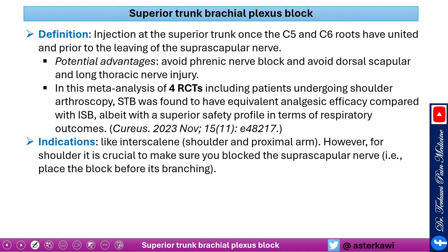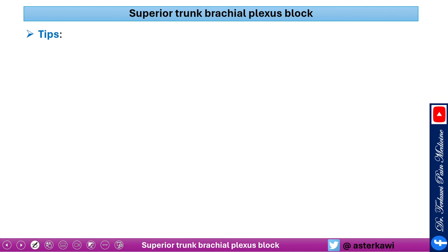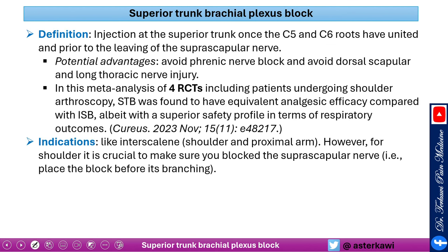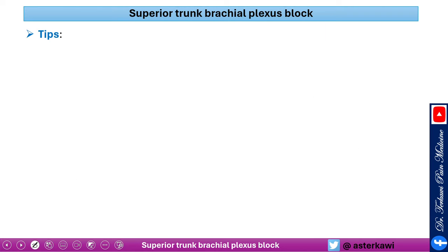The indication is similar to interscalene — shoulder and proximal arm. However, for shoulder surgery it's crucial to ensure you also block the suprascapular nerve. Sometimes supplementation with supraclavicular nerve block is also needed. Position the patient like the interscalene setup, start scanning from the supraclavicular fossa and move upward until you identify the trunks, then confirm by going up and down.